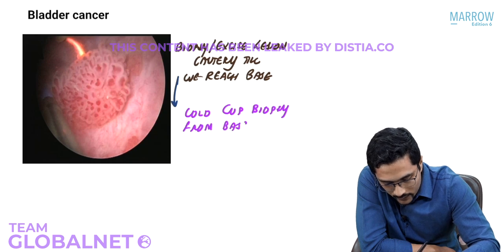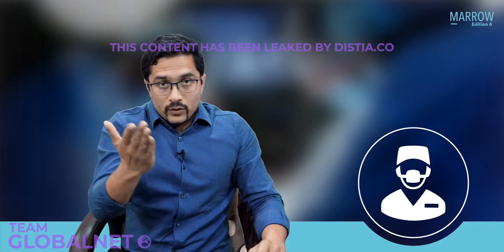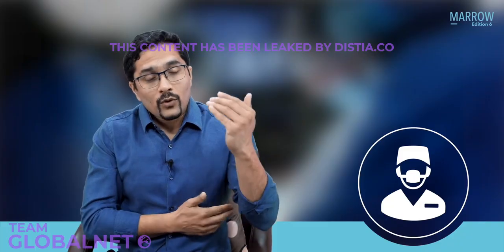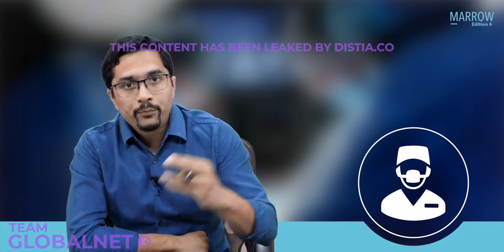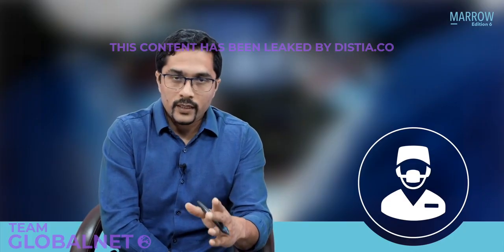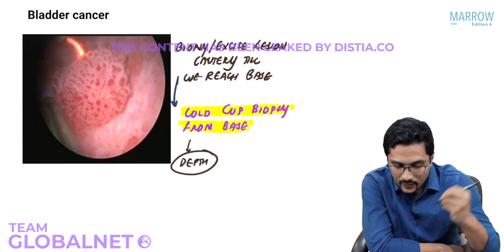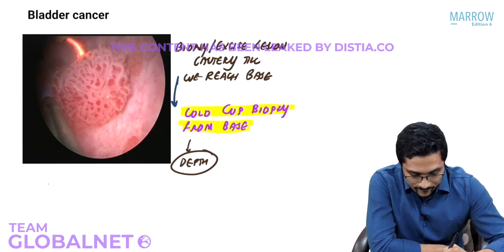What do I mean by a cold cup biopsy? That I'm not going to use the cautery. When I have to take the base, I will not use the cautery because cautery can interfere with the histopathological findings. So I'll make a cold cup, cold means without cautery, and I'll send this base separately to the pathologist to know if the base is involved with tumor or not. Right? So that is what we do, and that would help us in determining the T stage of the patient. That would help us in determining the depth of invasion in this patient. So this is how we confirm the diagnosis.